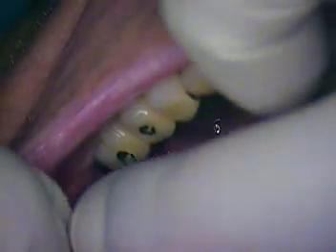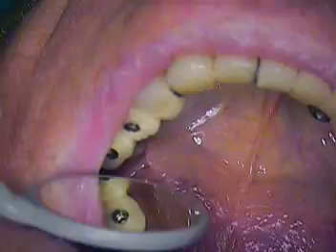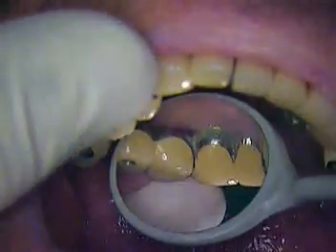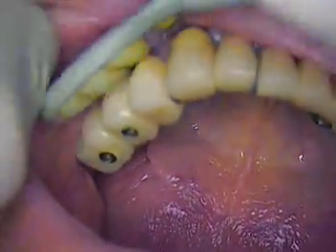We'll match up the amount of torquing from one to the other. I tighten this one. That's the one in the back — I've got to be extremely careful because of the threads, that was the one that had the damage internally. That's beautiful. Look at that — they're down nice and solid. Solid as a rock. And that's the way you do it.